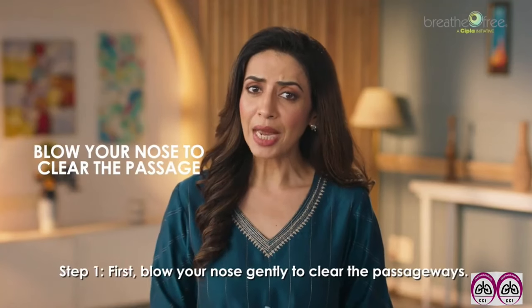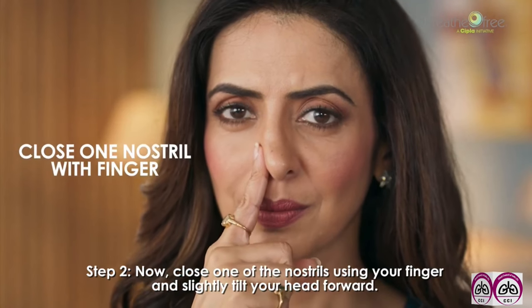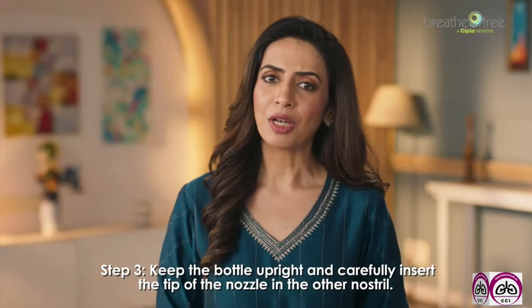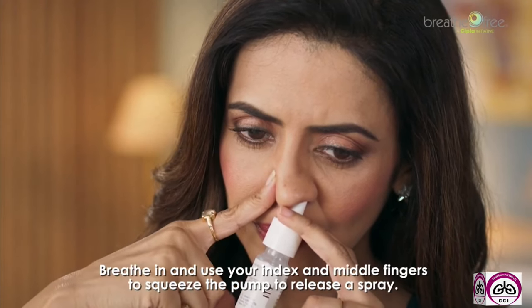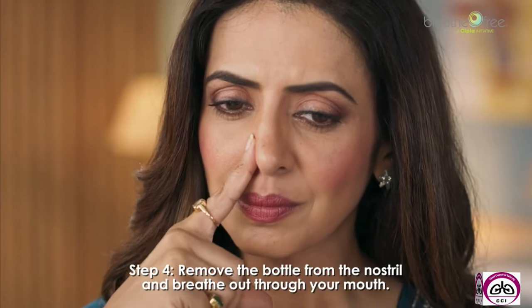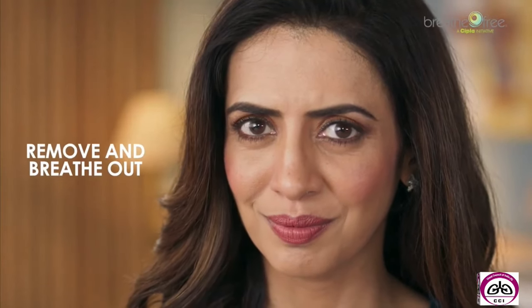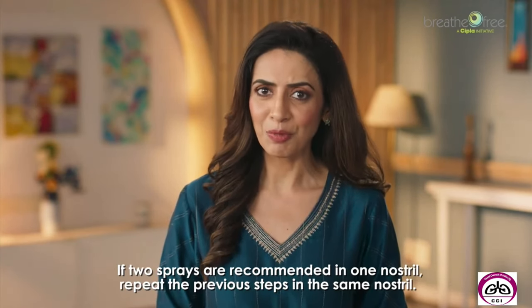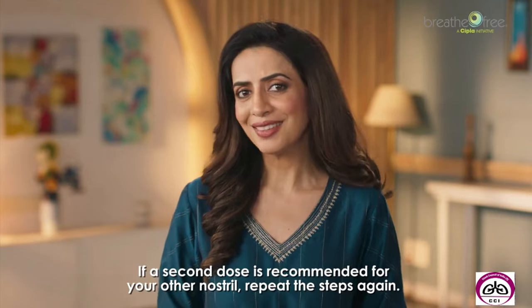First, blow your nose gently to clear the passageways. Step 2. Now close one of the nostrils using your finger and slightly tilt your head forward. Step 3. Keep the bottle upright and carefully insert the tip of the nozzle in the other nostril. Breathe in and use your index and middle fingers to squeeze the pump to release a spray. Step 4. Remove the bottle from the nostril and breathe out. If 2 sprays are recommended in one nostril, repeat the previous steps in the same nostril. If a second dose is recommended for your other nostril, repeat the steps again.